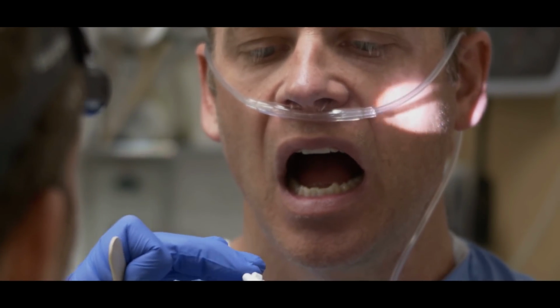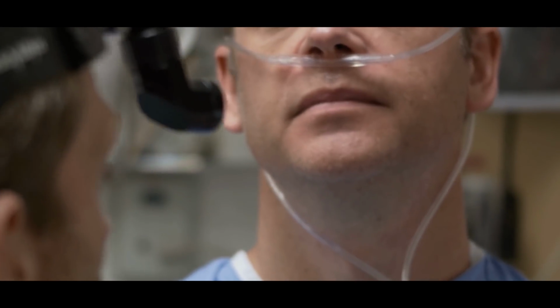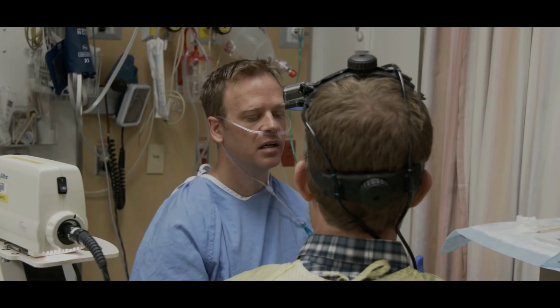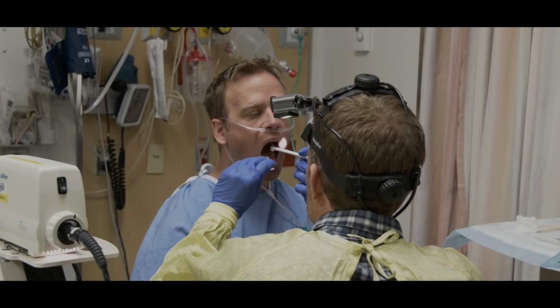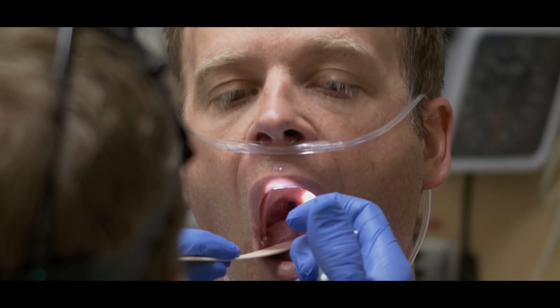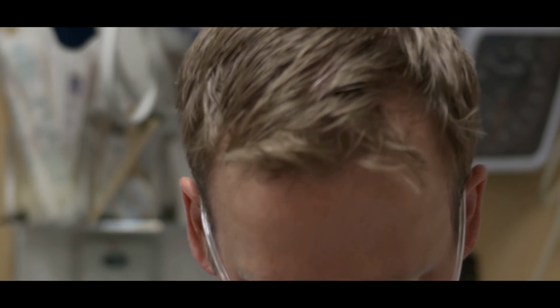So I'm going to turn it down now, just to get some, and what I'll get you to do, Chad, is just as I go in, just inhale, just breathe in, and that'll direct this down to where it needs to go. Okay. You okay? You ready to inhale? Okay, go ahead. That's going to cause you to cough. Yeah, so that's normal. So good cough there. Yeah. How's it feeling? That's fine. Yeah.